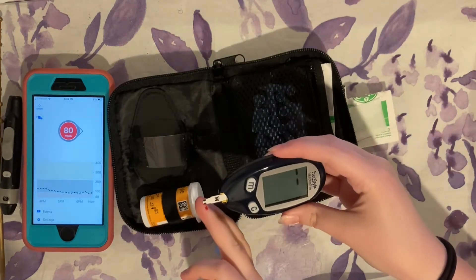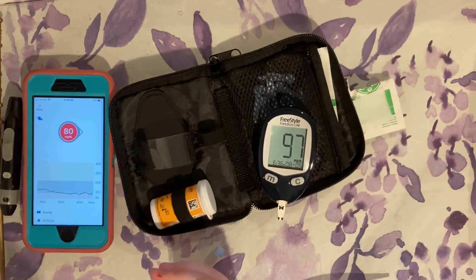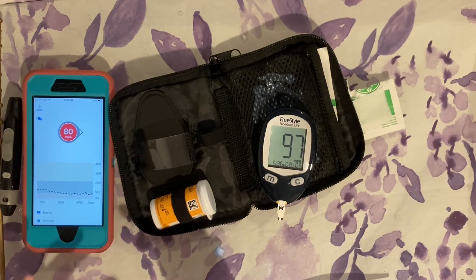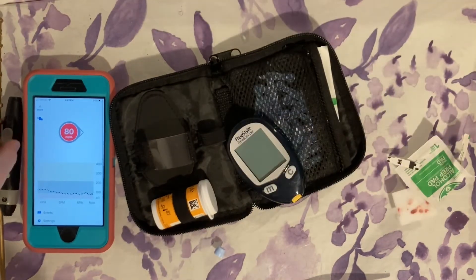Hold the test strip up to your finger. Wow — my Dexcom says I'm at 80 but my glucometer says I'm at 97. That's a good example of why you should calibrate, to make sure your Dexcom is accurate.